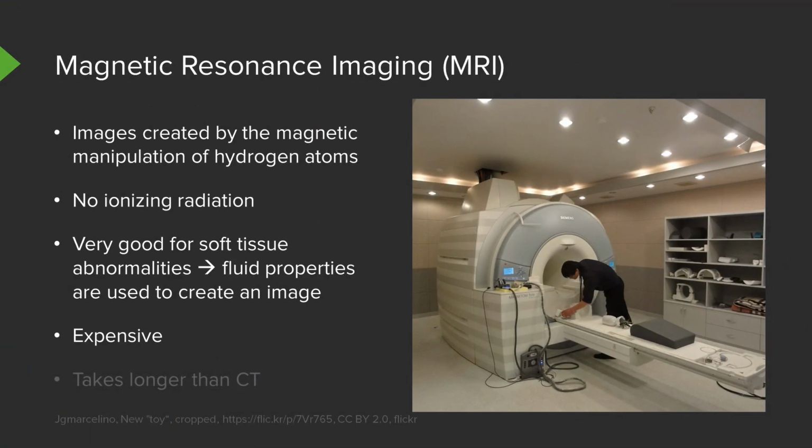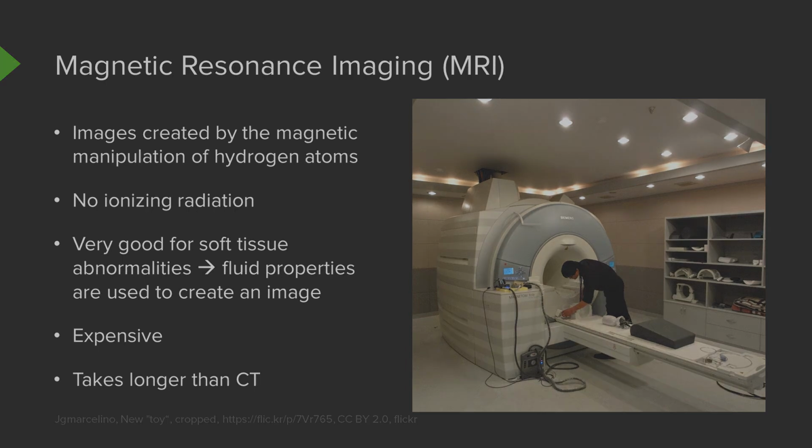MRI is actually a very expensive examination and can take a significantly longer time than a CT scan does. Depending on the body part that's imaged, MRI images can take over an hour to perform.